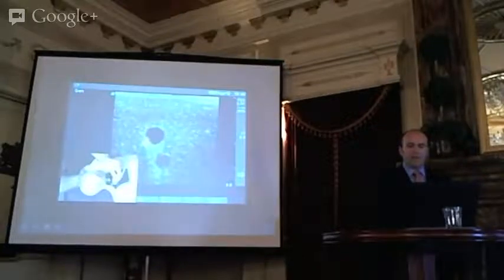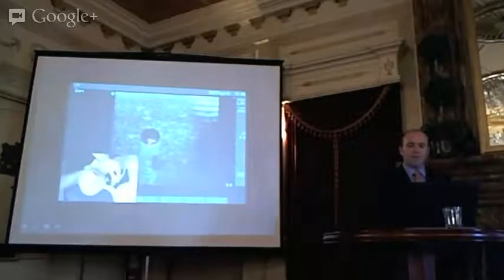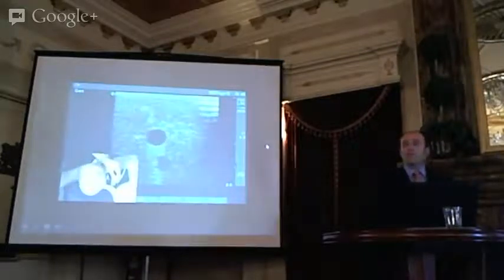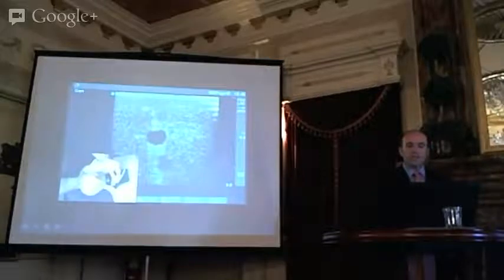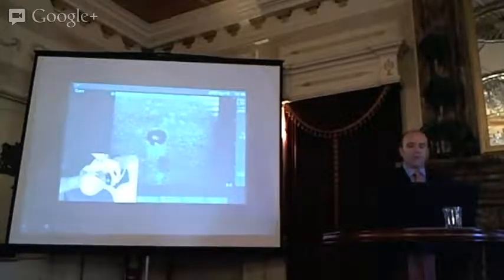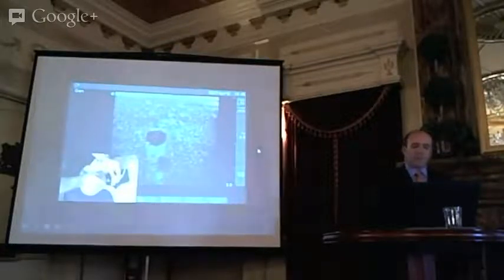And look at that, what happened? I lost track of the needle, and suddenly the next time I adjusted the transducer, it was all the way through. This is very easy to do. I'm not saying it's not easy to do under a long axis, but you'll see why it's a little bit different. This is just a common pitfall. There are plenty of people that are pretty good at this. The problem is there are situations that are ripe for inappropriate adjustment of the transducer, just losing the needle tip and going all the way through.